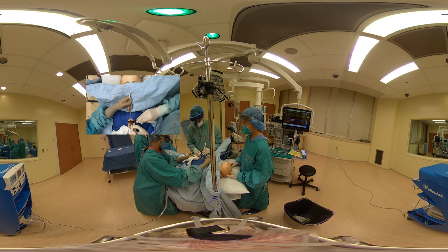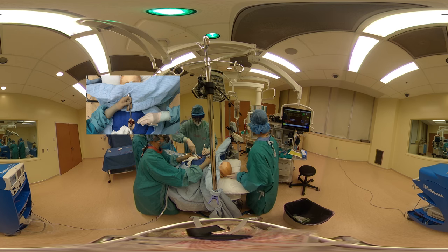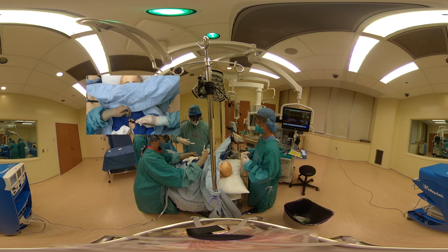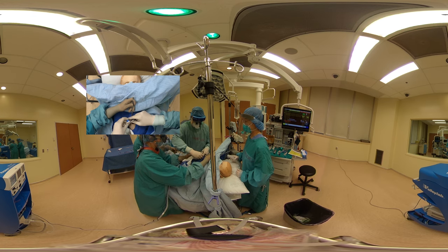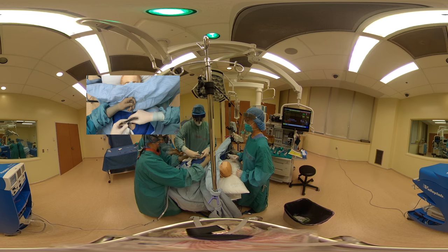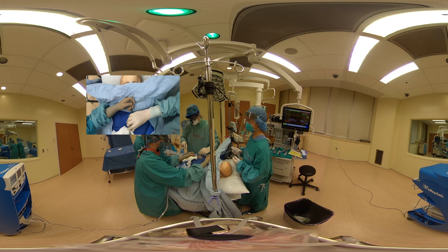So we're going to make our tracheotomy incision here. Take your scissors. Do this nice and quickly. Get our tube in. Inner cannula. Fully inflate the cuff, please. Excellent, the cuff is up. We'll connect our inline suction with our HME.